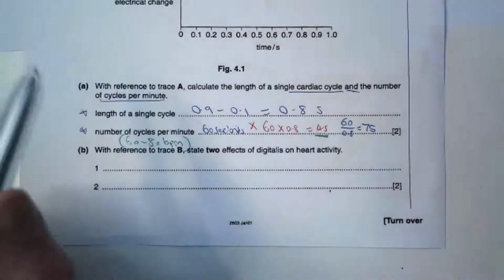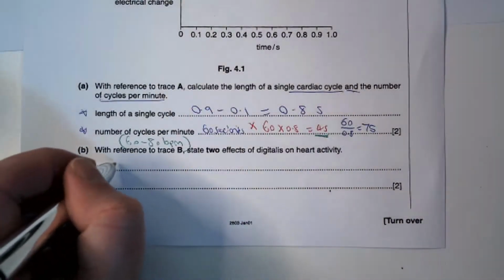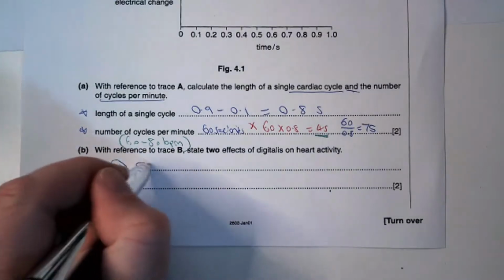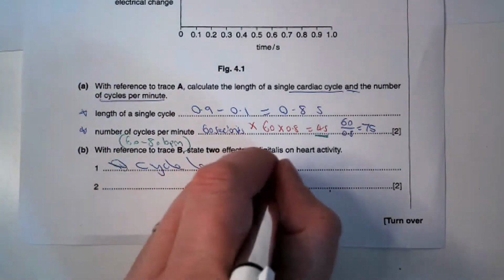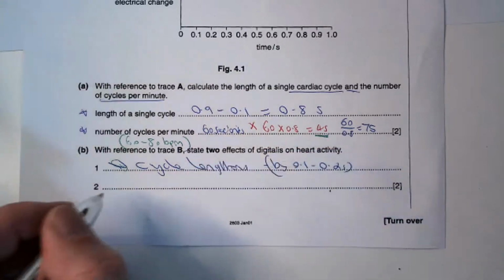So they're the 3 things that we need to be talking about. So we've got the cycle lengthens. It's about by 0.1 to 0.2 seconds, how much it increases by.